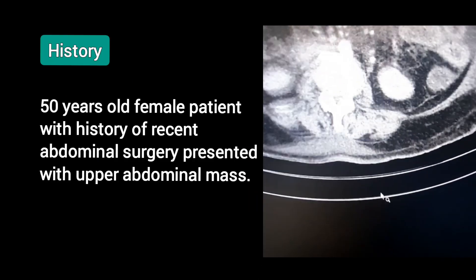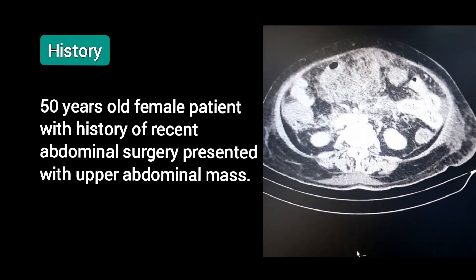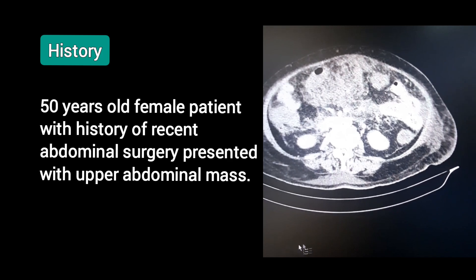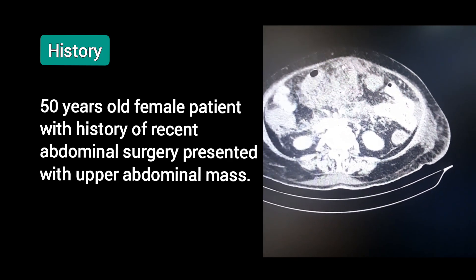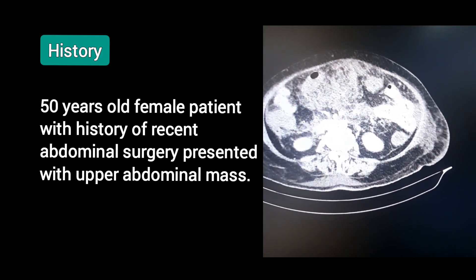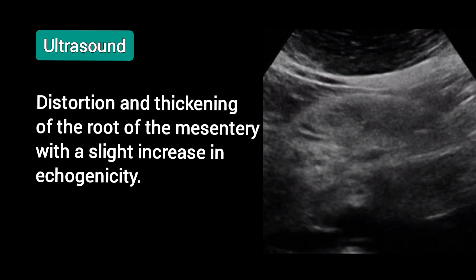A 50-year-old female patient with a history of recent abdominal surgery presented with an upper abdominal mass. Ultrasound shows distortion and thickening of the root of the mesentery with a slight increase in echogenicity.